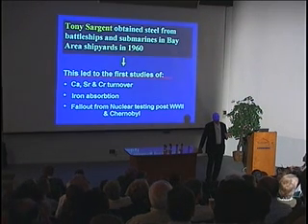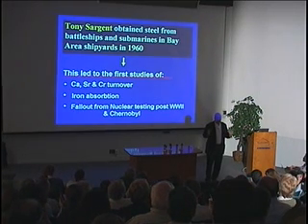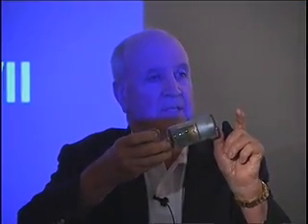So Tony Sargent went out in 1960 and found some, I think it was up to 16-inch thick plates from battleships, some parts from submarines, to put together a canister in which people would go and have something as simple as this photomultiplier tube connected to a crystal in the vicinity. So now I have a crystal called a scintillator. In comes the gamma rays, or out of the body come the gamma rays from, let's say, individuals exposed at Chernobyl. They hit the crystal, makes a flash.